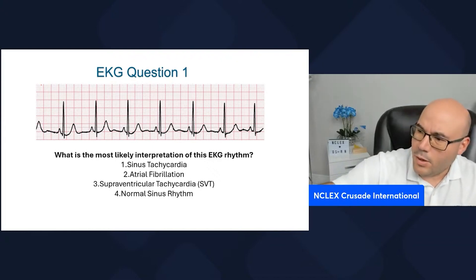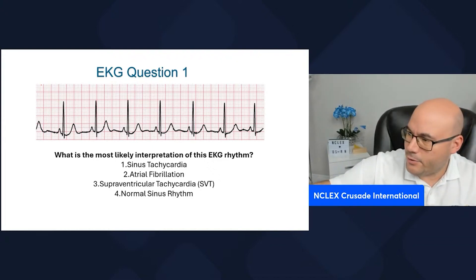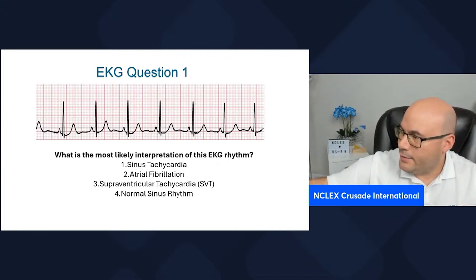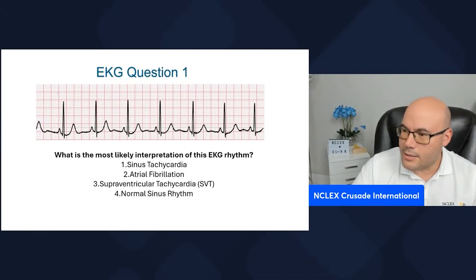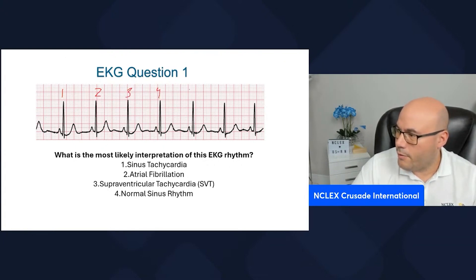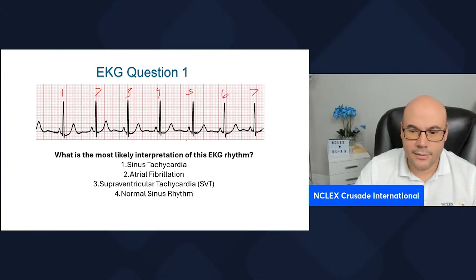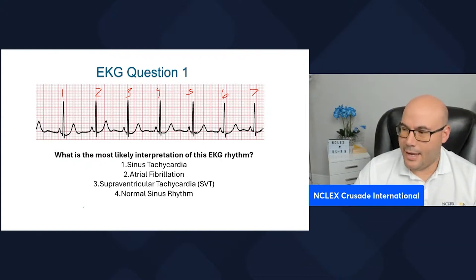Counting the big squares: 1, 2, 3, 4, 5, 6, 7, 8, 9, 10, 11, 12, 13, 14, 15, 16, 17, 18, 19, 20, 21, 22, 23, 24, 25, 26, 27, 29, 30 — 30 big squares. We have a six-second strip. Now counting the QRS complexes: one, two, three, four, five, six, seven — times 10 equals 70. So we have a regular rhythm and the heart rate is approximately 70 beats per minute.